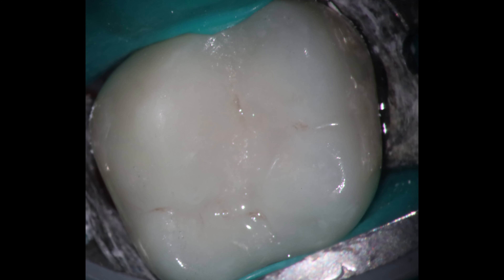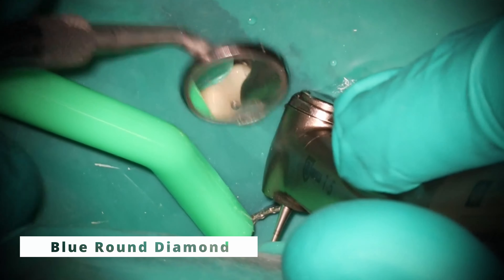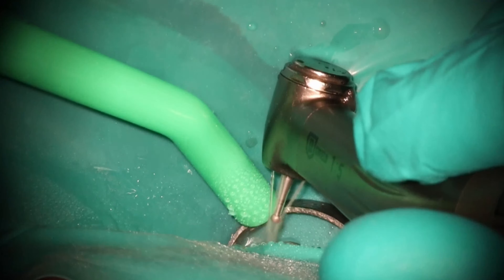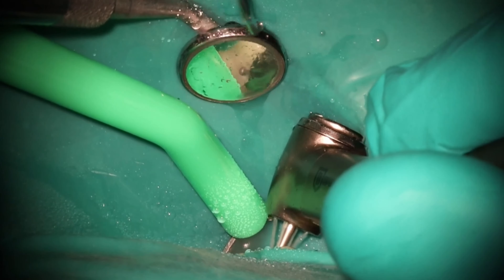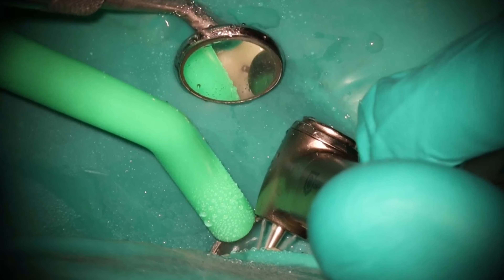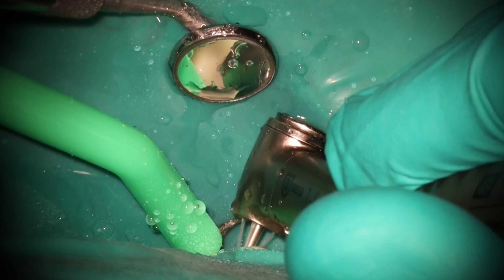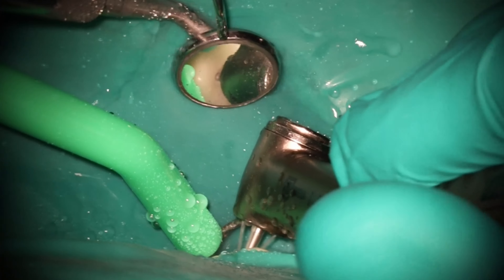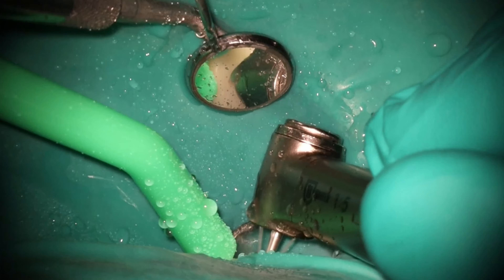You'll see later in the video — I do believe it was because it was filled short. There was a technique popular on the East Coast back in the day of using dentinal shavings as your final apical seal in the bottom two millimeters, give or take. The idea being that it would be a better seal if you use the patient's own dentin to seal it rather than gutta percha. Unfortunately, that doesn't work.